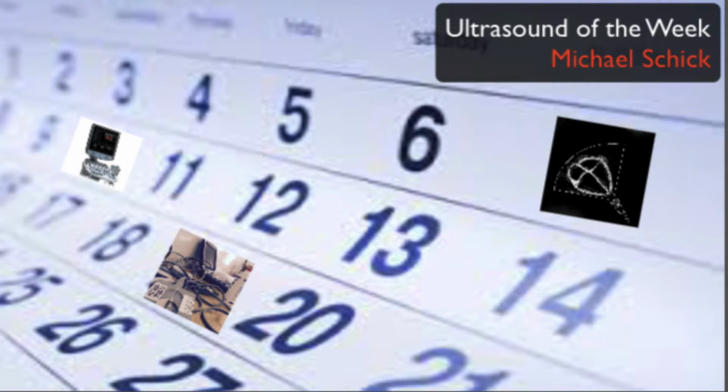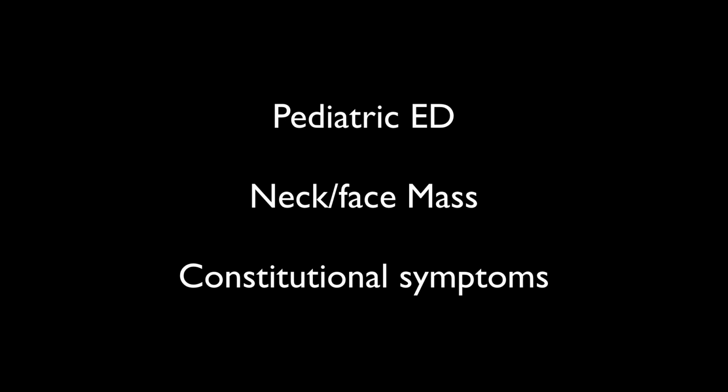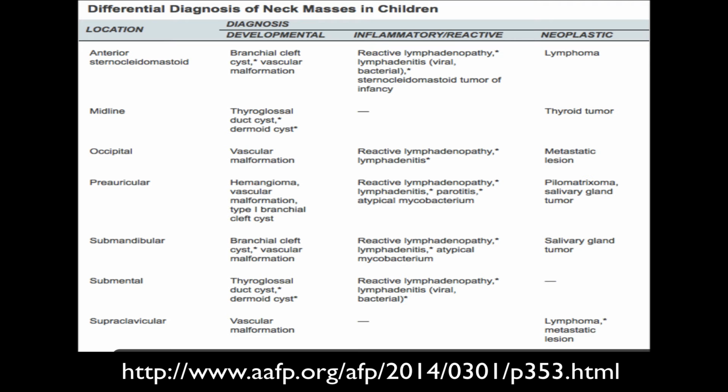Let's get right into it. Now, Jim and Trevor had a single-digit aged child come into the pediatric emergency department complaining of a few days of a growing mass underneath his mandible along his superior anterior part of the neck. And that's pretty much what they found on physical exam.